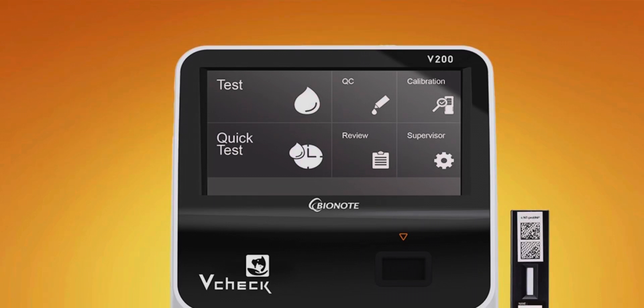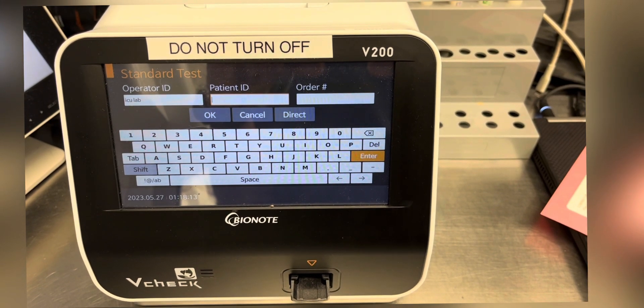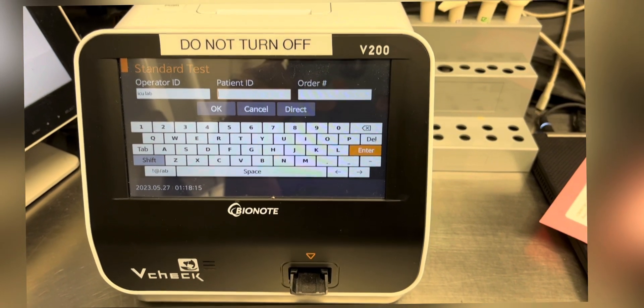Hello everyone, this is a quick reference video for the Bionote V-Check machine. The V-Check machine is a point-of-care diagnostic device used to measure some important biomarkers and hormones in the blood, such as cortisol, D-dimer, feline and canine NT-proBNP, progesterone, and so on.